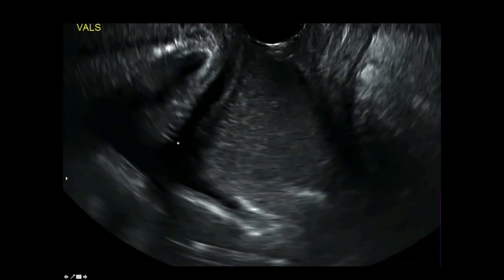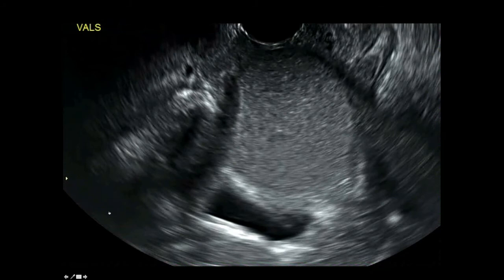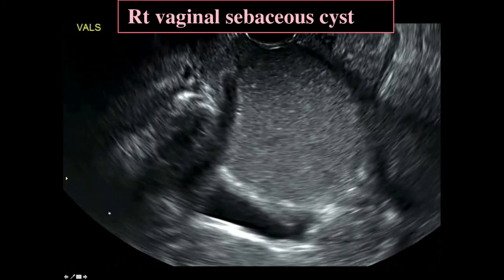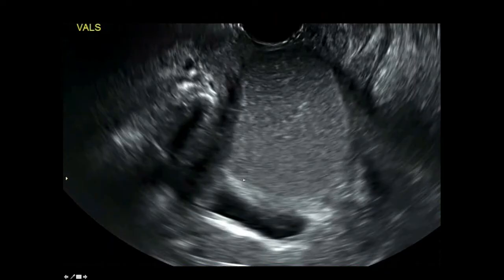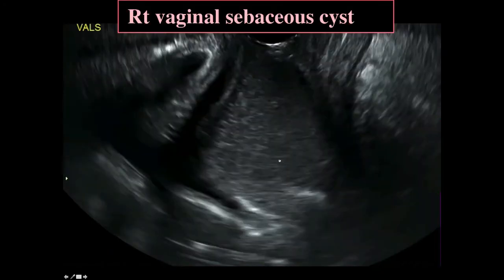Here's the urethra. There's the bladder. There's the rectum. Let's see what happens when she Valsalvas. So here she's Valsalva-ing. This whole thing is coming down through the vagina, sort of trying to come out of the vagina. Let's go back one more time and run that clip again. You can see as she pushes, the whole thing comes down en masse, and so this turned out to be a vaginal sebaceous cyst.